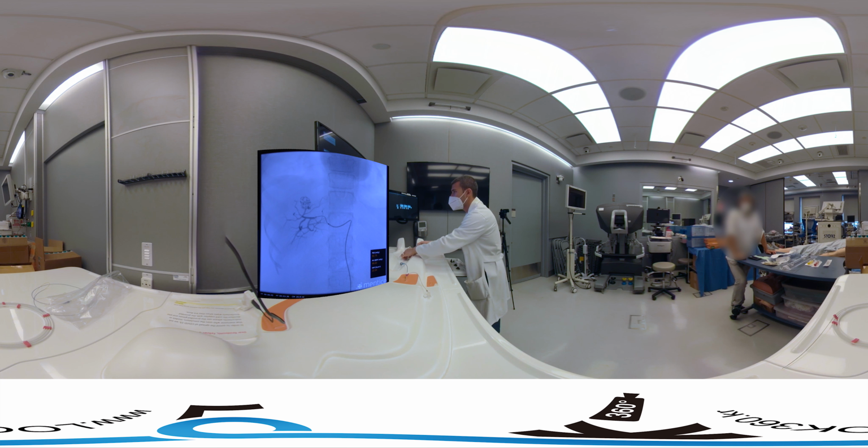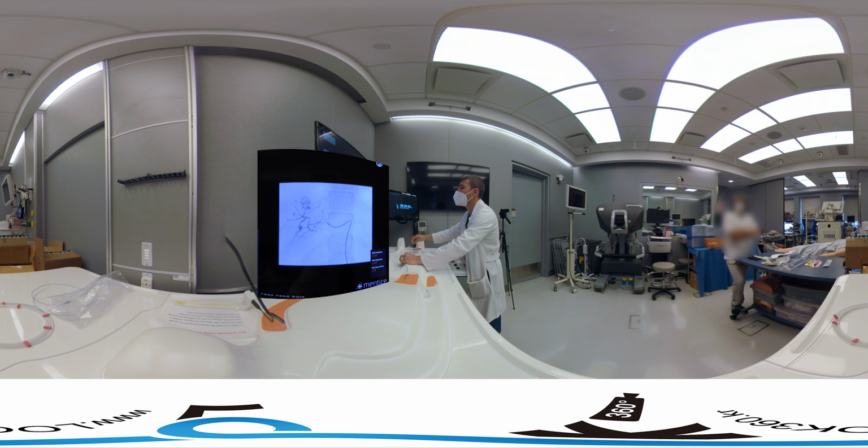Okay, so after some catheter manipulation with the microcatheter, we're able to get into the right hepatic artery. Right now, we're getting farther and farther into the right hepatic artery, trying to select the branch that directly supplies the tumor. So we'll do a little injection here, and I'll show you where we are currently. I'm going to do a little bit of collimation on the area of interest. And you can see that it's a branch vessel that comes off kind of superiorly, a couple centimeters down. Again, you can see the nice staining within the tumor. So we're going to get our microwire out a little bit farther, kind of in that direction. We're close. So we're going to bring the microcatheter out just a little bit farther. We'll see if we can get into something that goes straight up to the tumor.